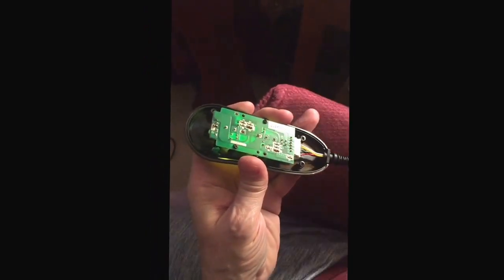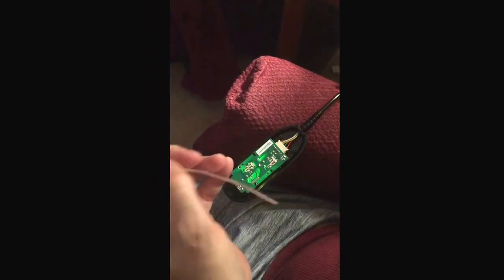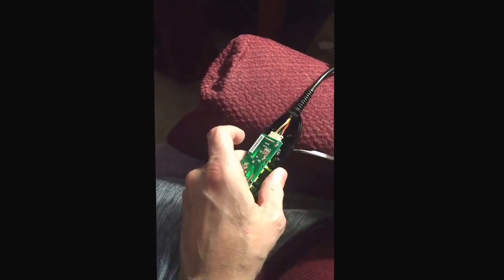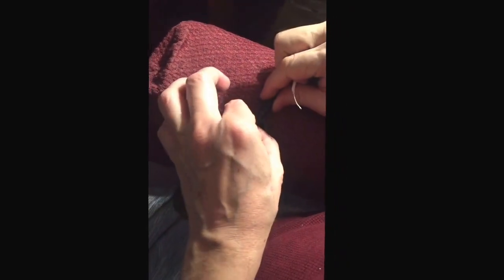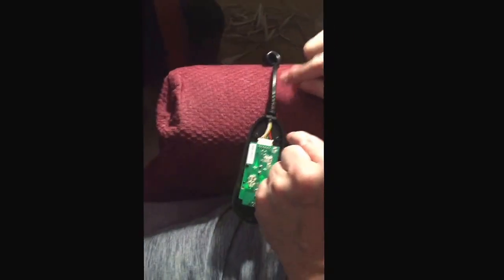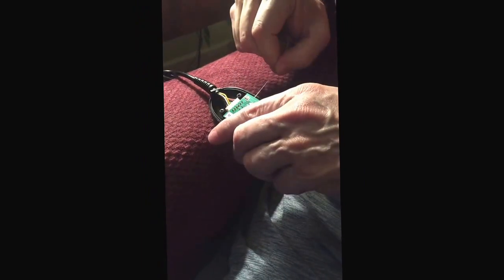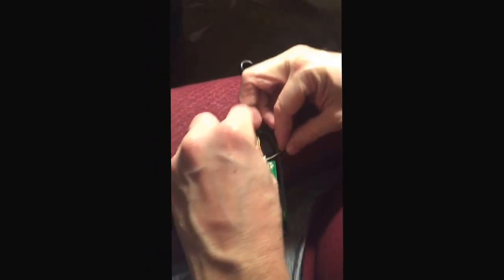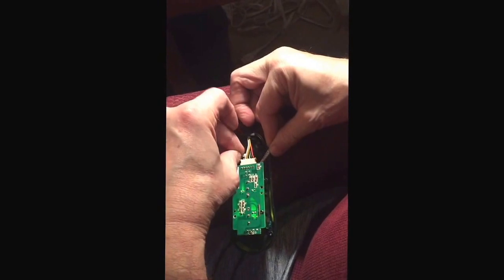So to fix it for good, I'm going to use a bread tie and put it around here to hold these 2 pieces together. Well, first off, I pulled the wires out of this casing here to give some slack, so that it wasn't pulling so hard. But now I'll go around this way, kind of come in between some of these wires just so it has something to grab onto.